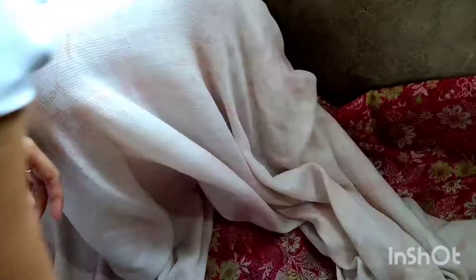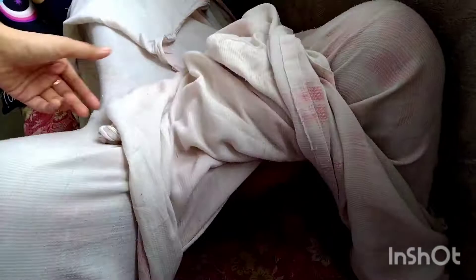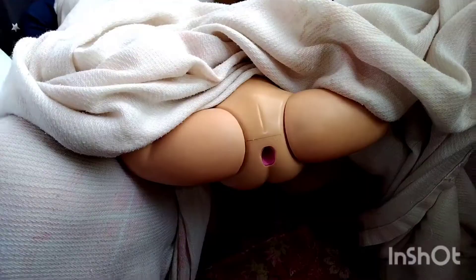Next, drape the patient with top sheet to expose the perineum and avoid unnecessary exposure of body parts, maintaining client comfort. After draping, assist the patient to the side near you. Loosen the foot part of the top sheet and use diagonal draping. This helps expose the perineum while maintaining client comfort. Next, provide perineal care if needed. This reduces the presence of microorganisms near the urethral meatus.